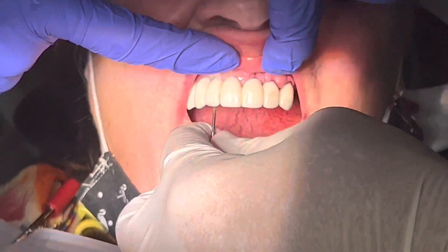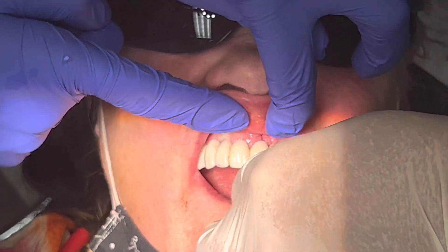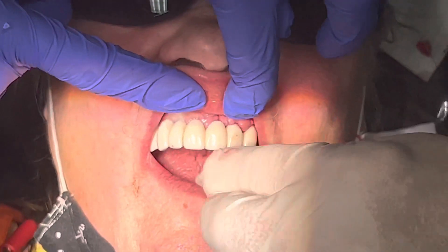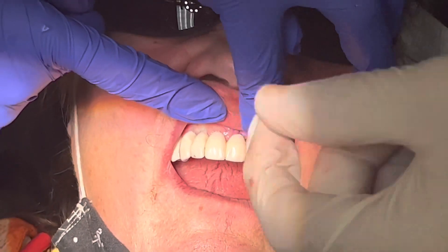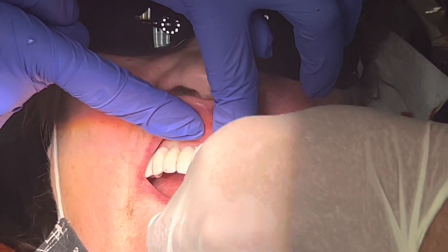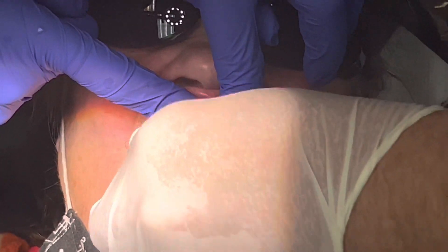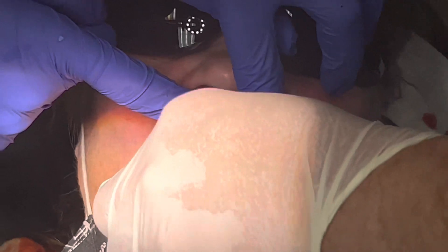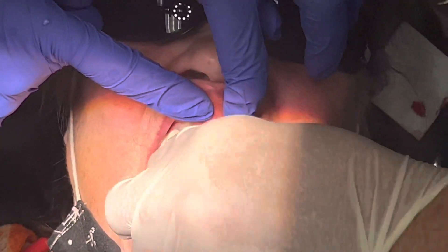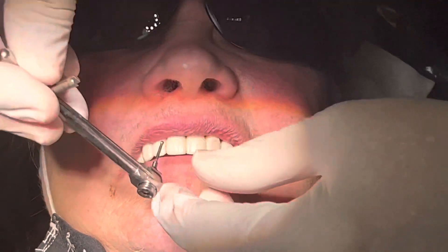Don't make things too complex. Patients will often come in and say, 'I'm so sorry doctor, I broke this' — that's what we're there for: to learn how to deal with problems. Learning how to deal with a problem like this is something all of us can do. We have to get access and have some type of strategy, but you don't have to have expensive tools, as you can see. This will enable you to get the job done and get the patient and yourself back on track.